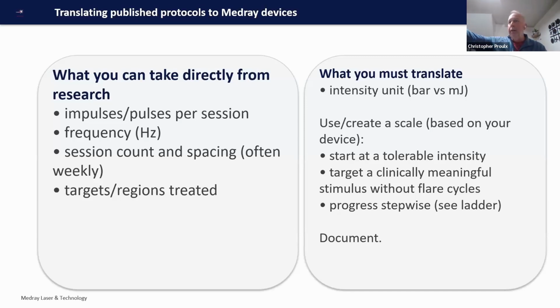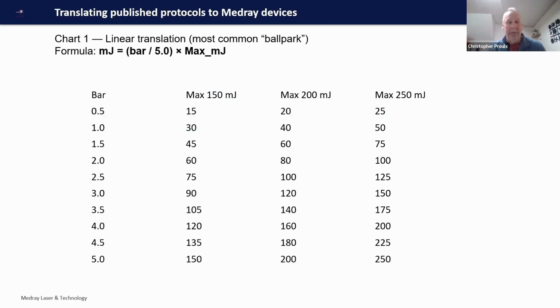I was giving a presentation to a sales group on cervical traction, for example. And I'm like, yeah, you can start at 8 pounds in a low coefficient friction design system. And everyone was freaking out because they're like, well, Medicare requires it to be, blah, blah. I'm like, yeah, you can progress to that. You don't have to start with that because that might actually put them over the edge. If you hit someone too hard with these devices, you can flare up. They may not like that. So we can actually use a stepwise approach, which we'll look at here in a second.